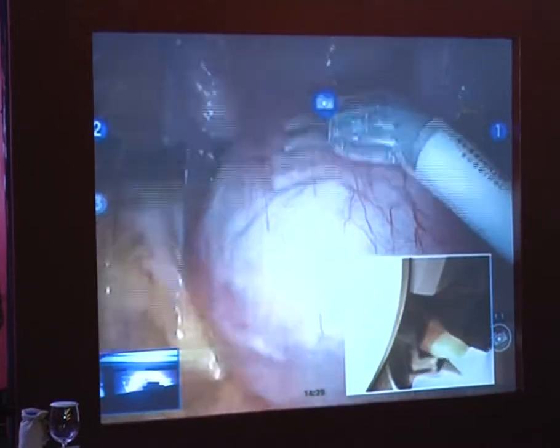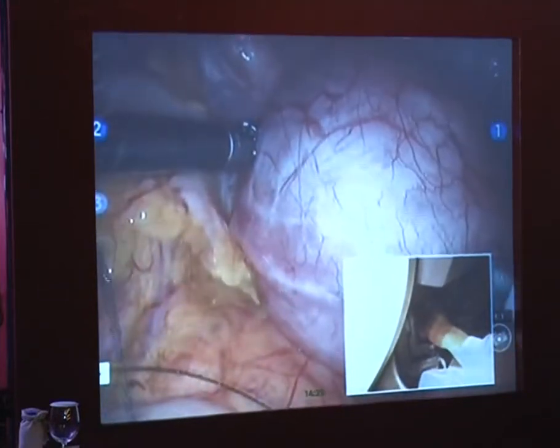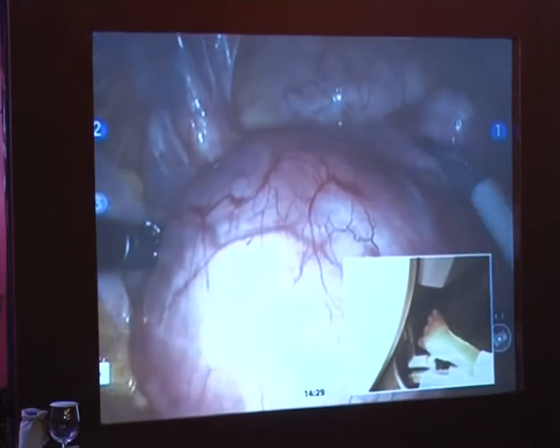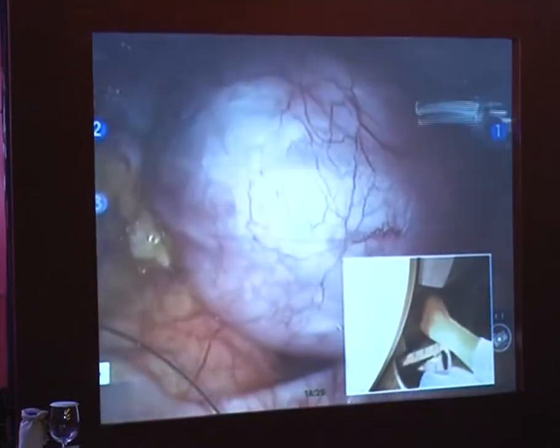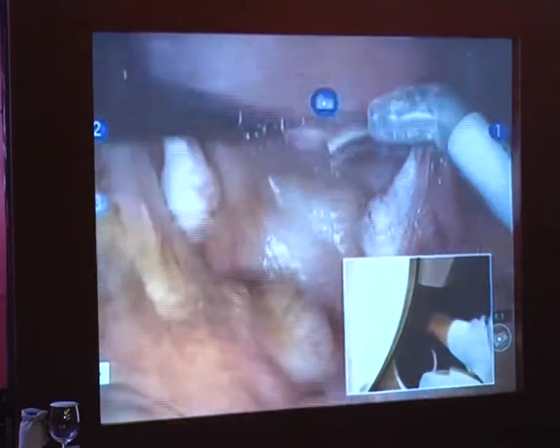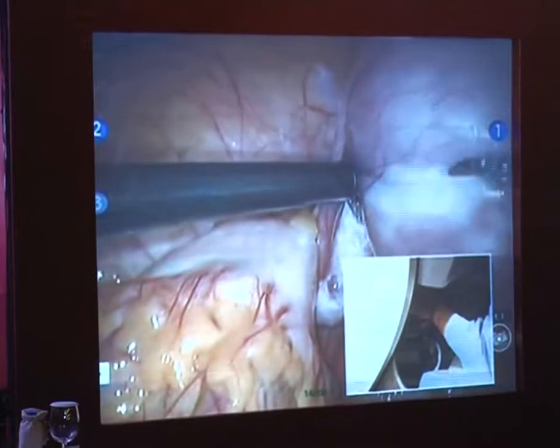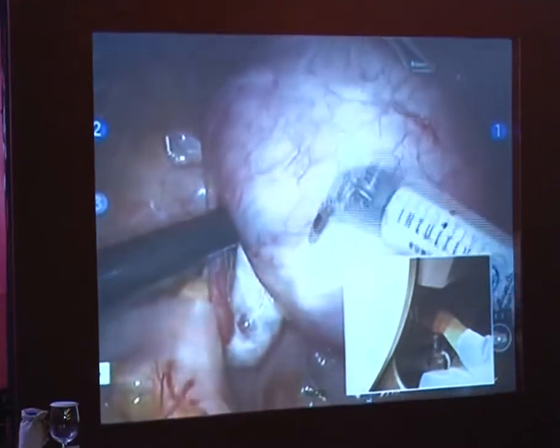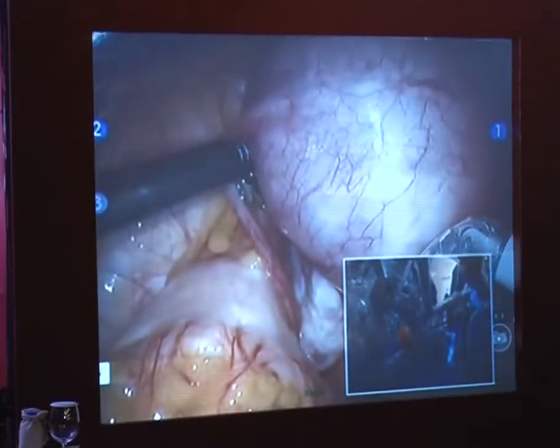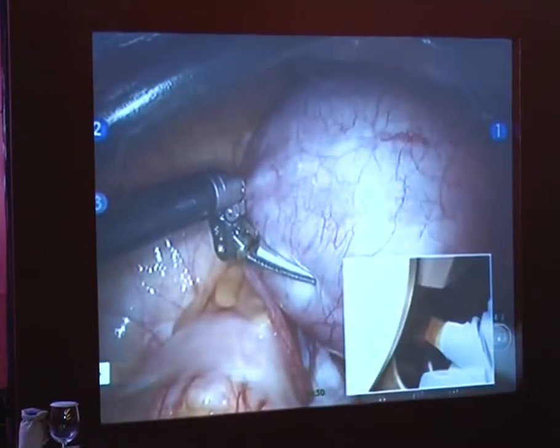Yeah, that's pretty good. And slide it on in. The key is to get it just in the myometrium surrounding the fibroid. Okay. Excellent. Look at the way he's guiding the needle. How many cc's is that? No, I mean, how many did you inject? Just do 1 to 2 cc's at a time. Okay. Just do about two per site. Inject after you withdraw back. Good. Okay.